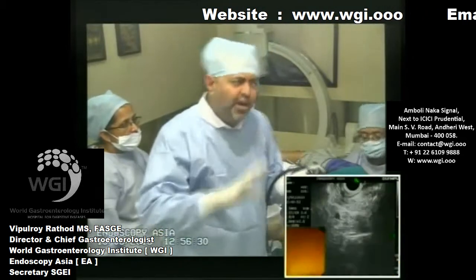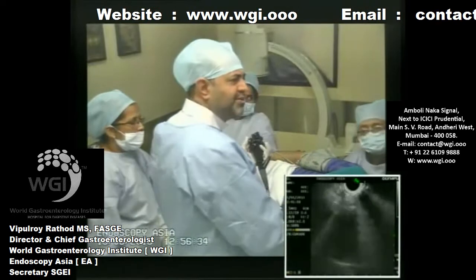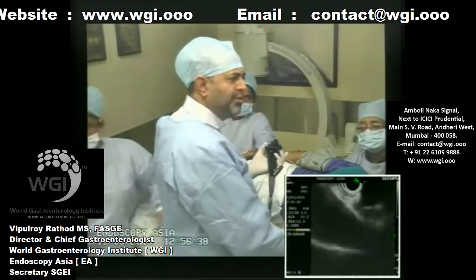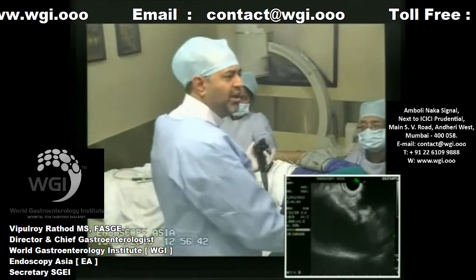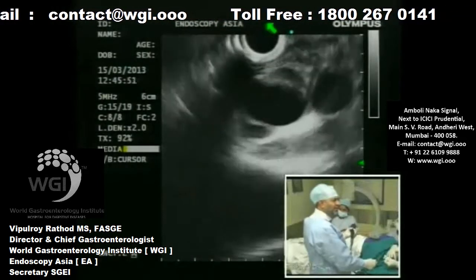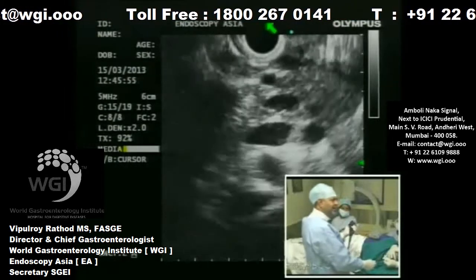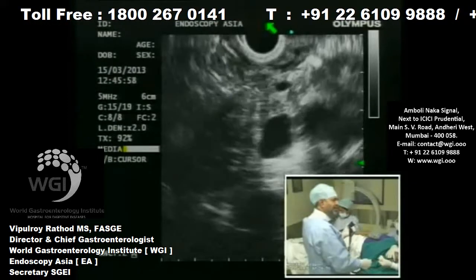So I'm just trying to figure out what is the best option for this patient. We still have some time, so I'm going to discuss the possibility of what is to be done in this particular patient. So I'm going to go back again to 5 megahertz. A very effective choice of frequency is important, and this is what we have learned over many years of experience. And now I'm seeing the pancreas here. Look at this pancreas. The pancreatic head here.